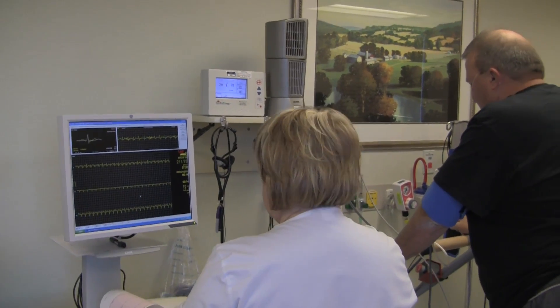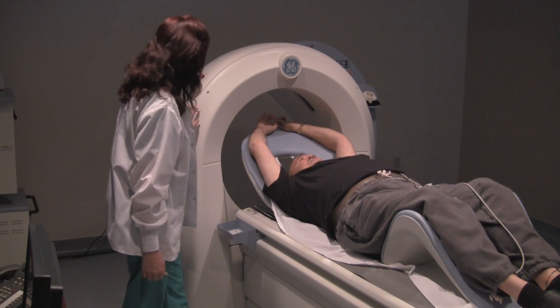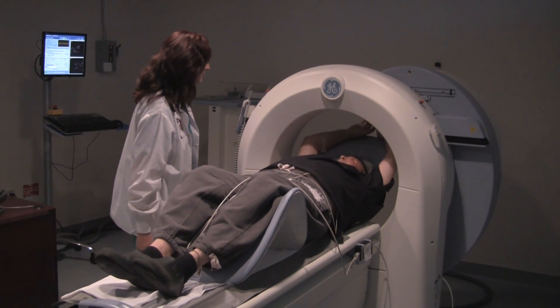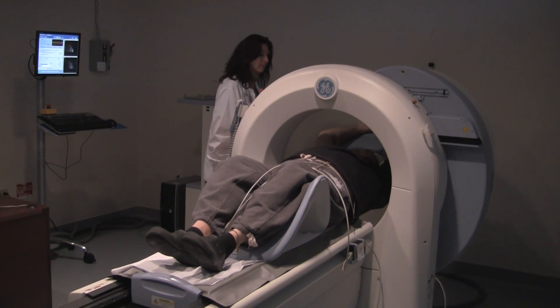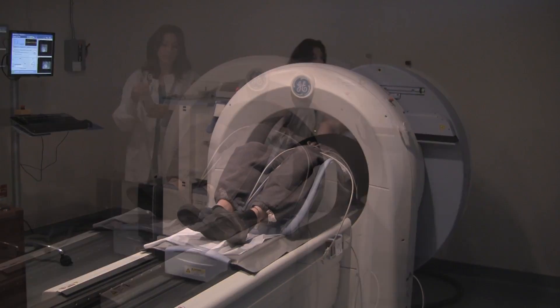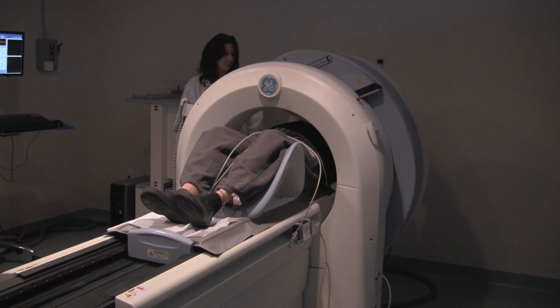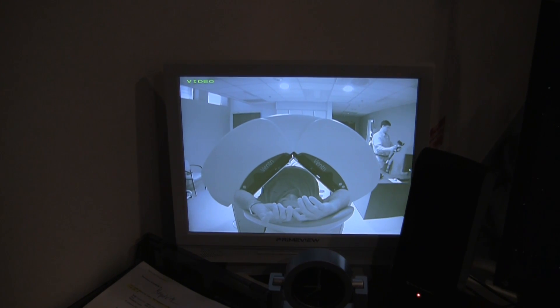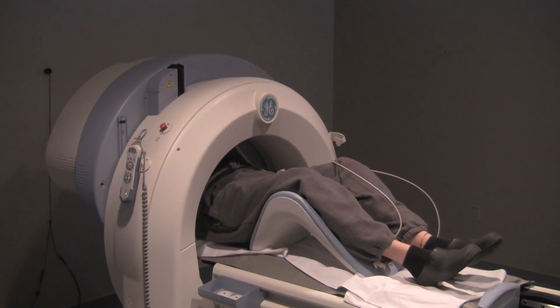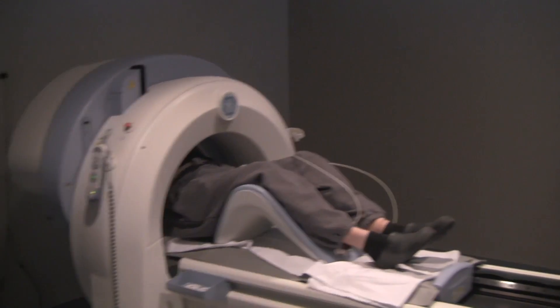Alright, I'm going to see you in an hour and we'll scan you. I'm going to bring that camera in. It takes 15 minutes. This is his stress imaging — after this we'll inject him again with the radioactive tracer, and then he'll rest for about an hour. At that time he can go eat, take his morning medications, and then we'll have him return back and we'll do the same scan again. And that will complete his study.